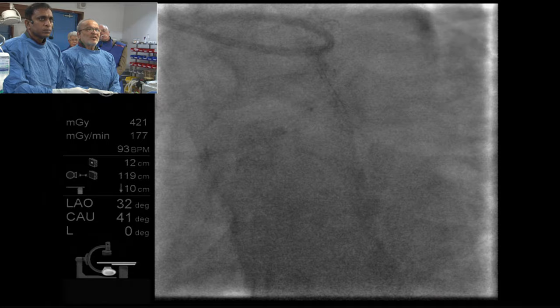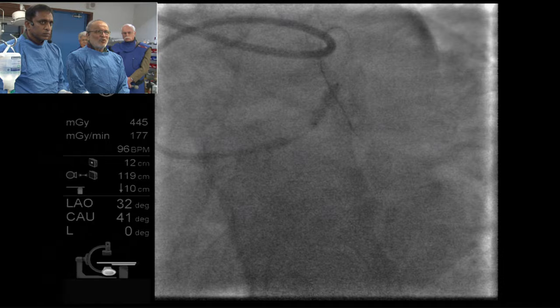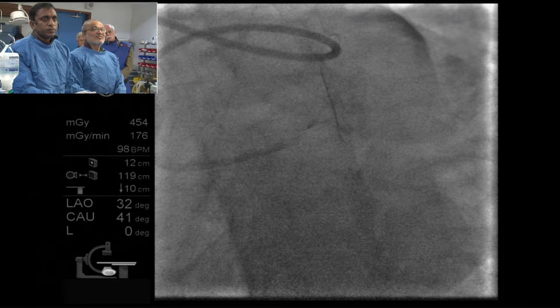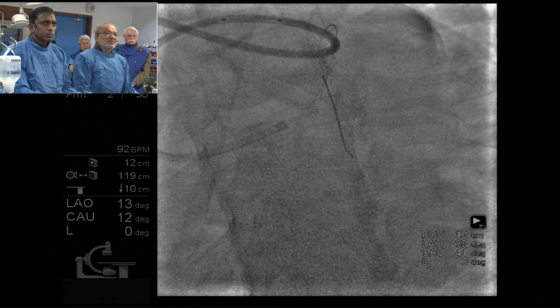Do you guys really think it makes a difference changing drugs? Does that theory really hold some substance, Rajiv? Changing the drug? Well, the two randomized trials that I know of, the SWITCH trial and I can't remember the other one, showed it didn't make any difference going from, I think, a limus to a taxus and the other way around. But we don't use paclitaxel anymore, and it seems to me to make sense to do something different. If you haven't got an obvious mechanical contribution, then doing something different seems to make sense.